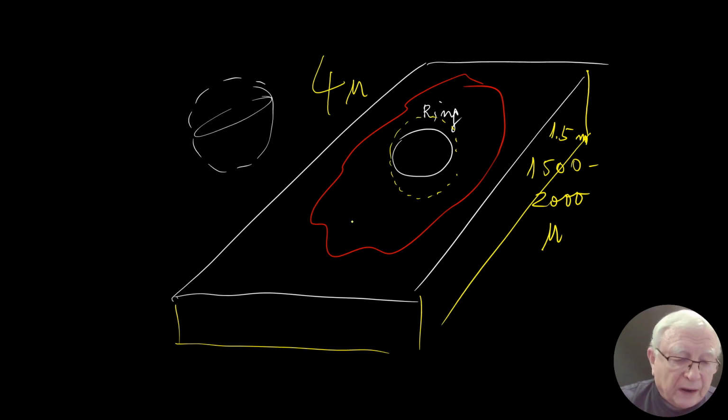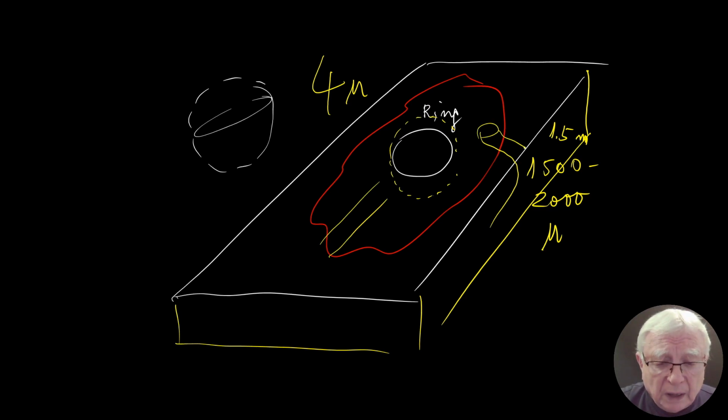Or our friend, a duct, is going to be like a railroad on a 4-micron section. But on the 3D, it's going to be a tube. And it bends here. It doesn't matter because you have the depth.